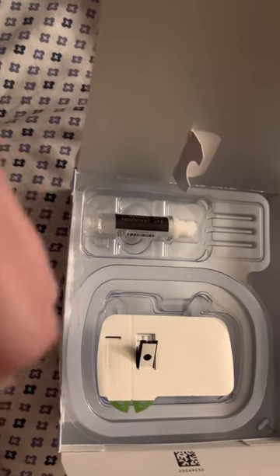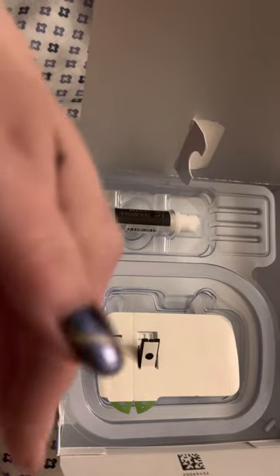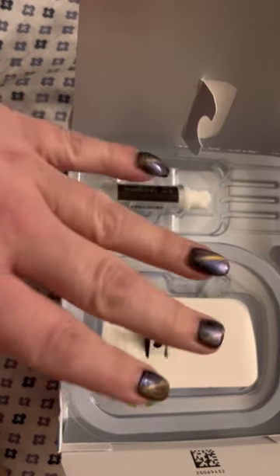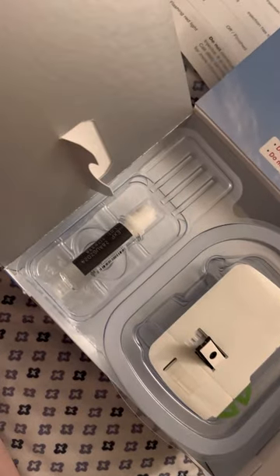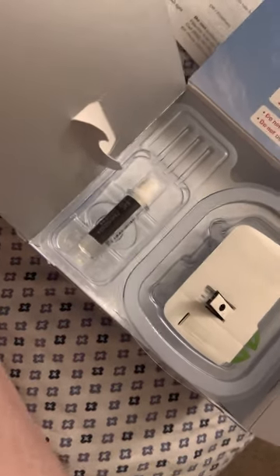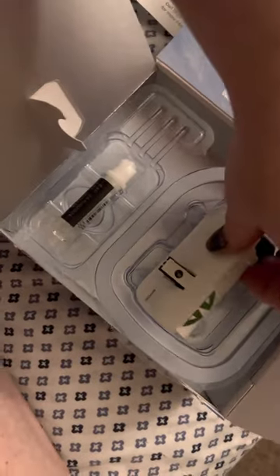Do not push on the bump where the medication goes into your skin. Just leave it alone. So what we're going to first do is alcohol swab the area.